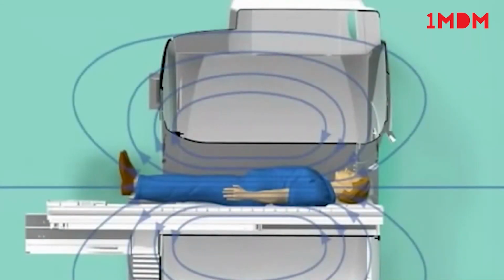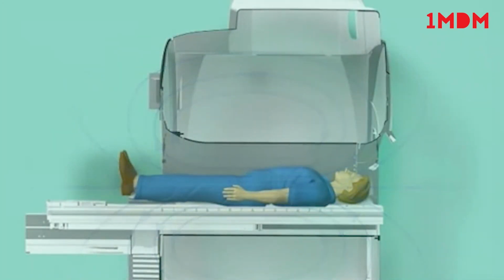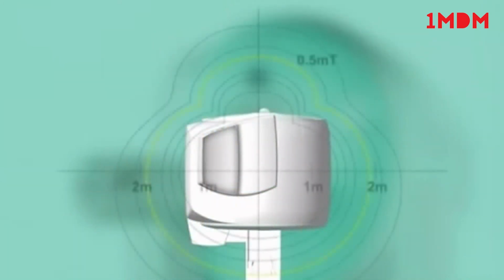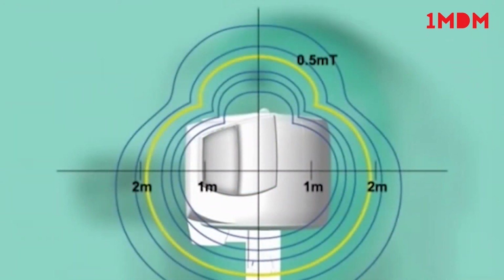For MR, the magnets are large and shielded so that their fields only act inwardly on the patient and quickly fade in an outward direction. This differs for various systems and depends on the field strength and the design of the magnet. The use of magnetizable objects in the area of the fringe field, the stray magnetic field, is strictly prohibited since the MR system exerts an attractive force on them.